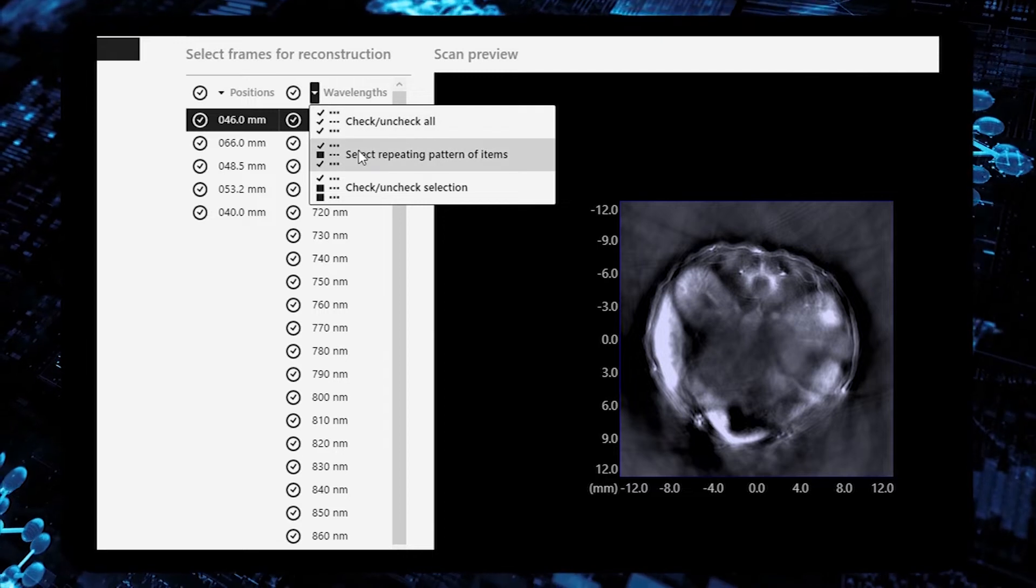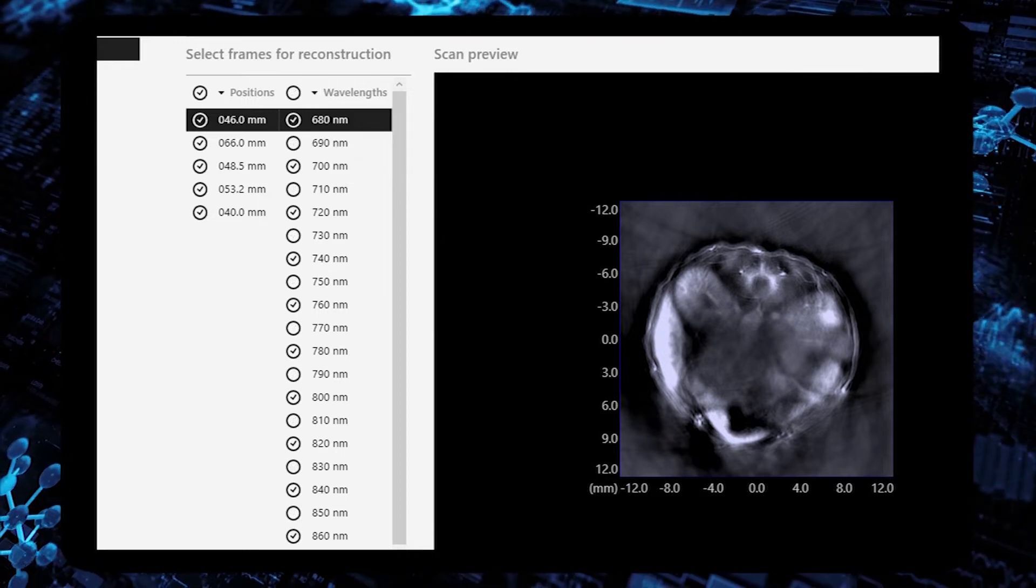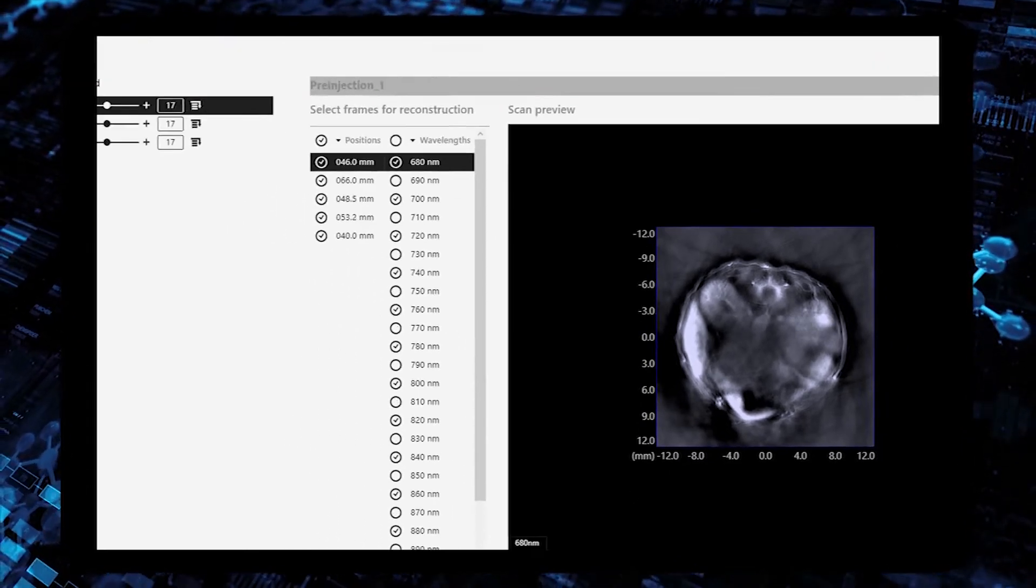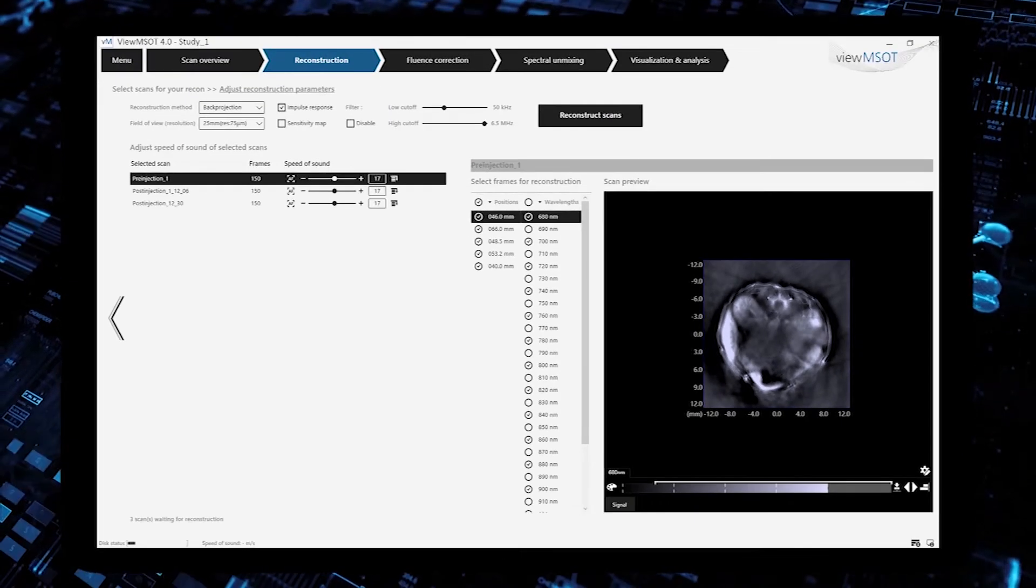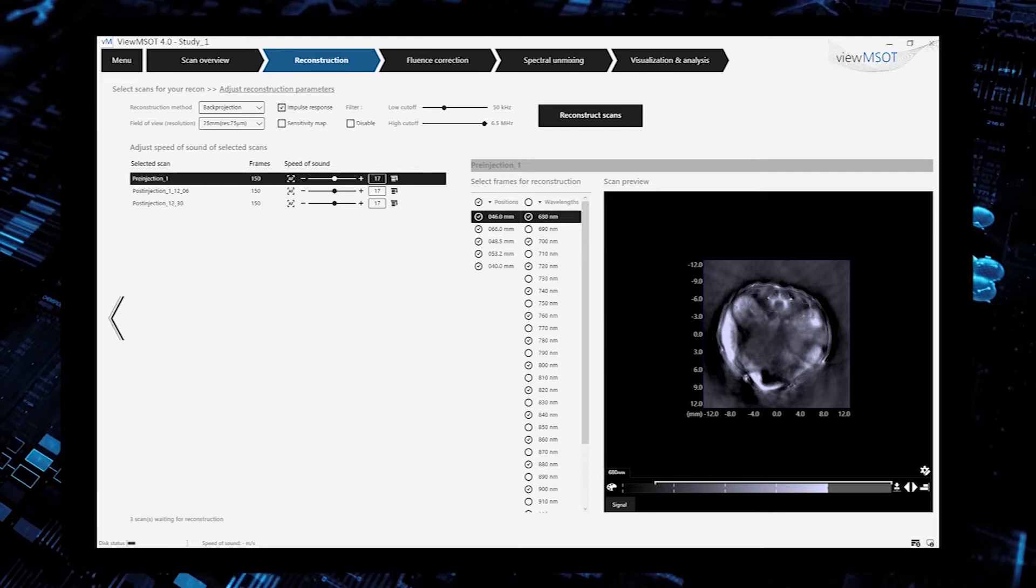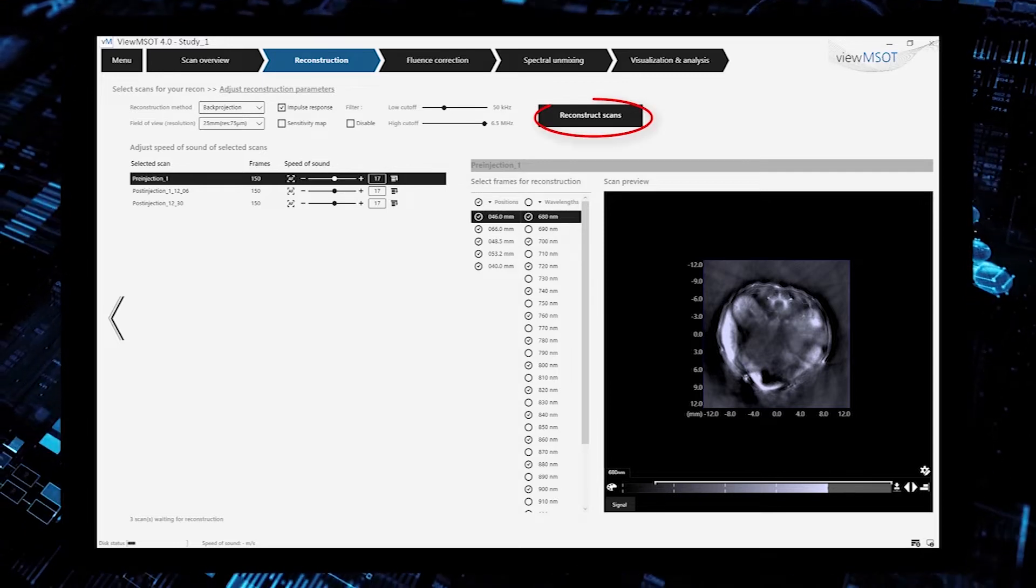Finally, you choose whether to reconstruct all or a part of the data acquired, and start the processing.